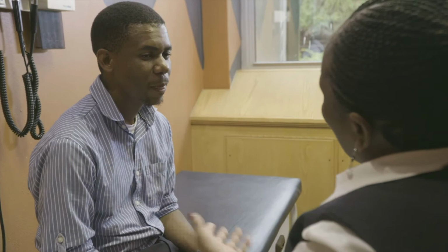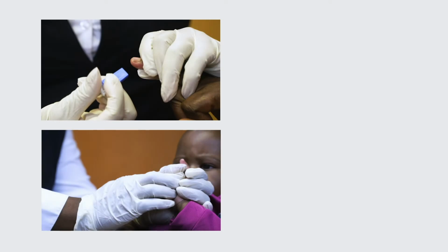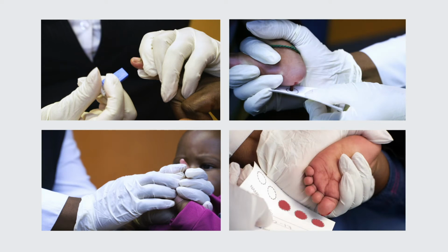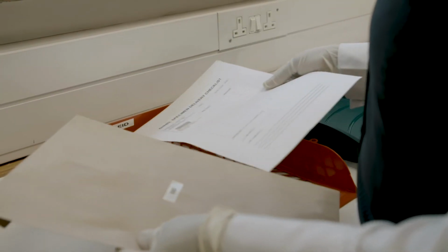Knowing how to collect a DBS sample from a patient who is on ART for HIV viral load testing is the first step to evaluating how well that person is responding to treatment. Only a few drops of blood are needed. They can be obtained from a simple prick of the finger in children and adults, or heel or toe in infants. The blood spots can be easily dried, stored, and transported to the laboratory for analysis.